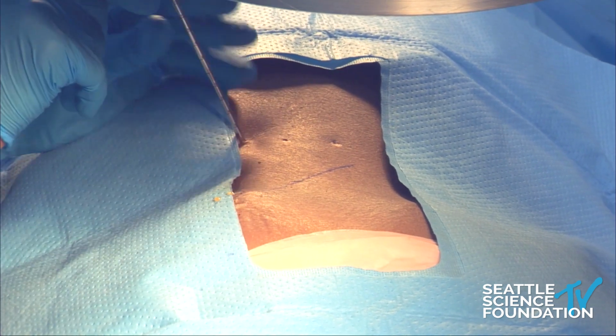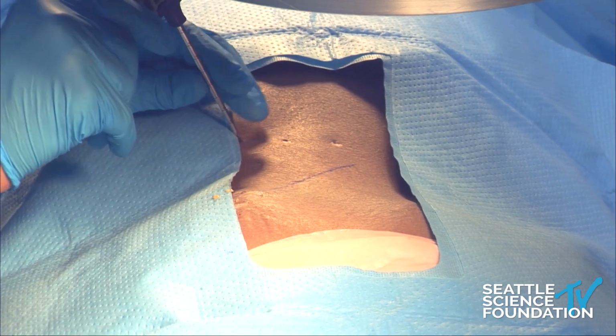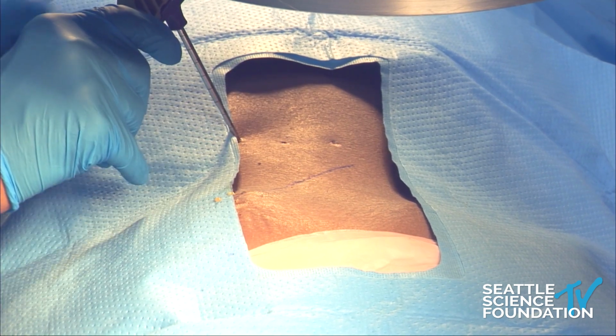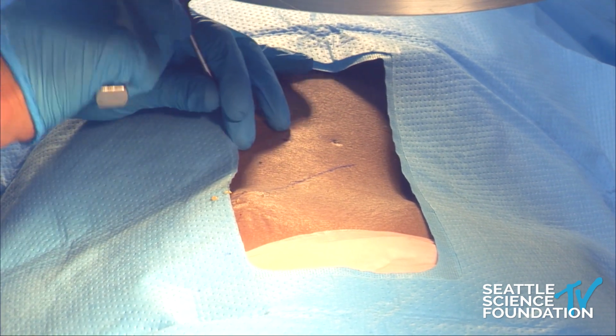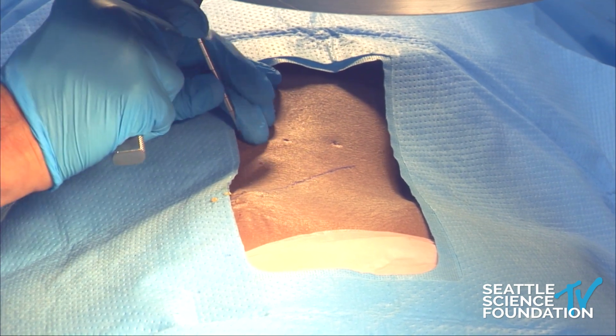I'm using the beveled needle. We'll come down, we'll make contact with the 10 o'clock region of the pedicle. And we'll go to a 30-degree angle and we'll hammer that in. And one of the things about the bevel that I like is it's directional controlled.